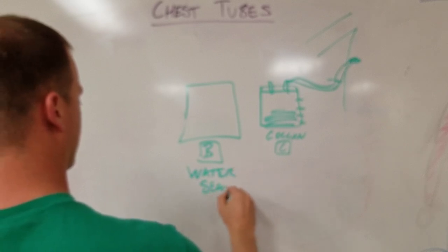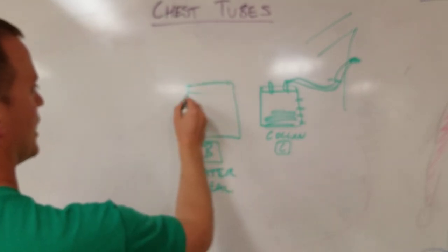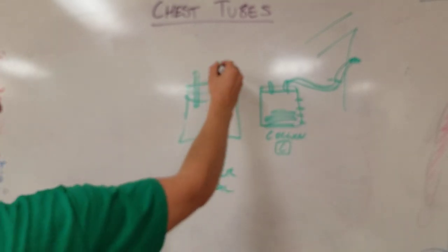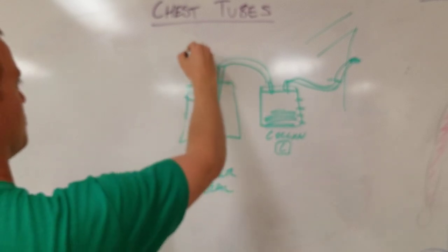seal. Now, what this does is it has the same deal. Cork on the top, a long glass pipette, and a short glass pipette. What we're gonna do is attach the Charlie chamber to the Bravo chamber, and then we're gonna put this to suction.